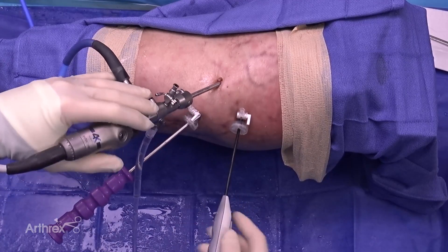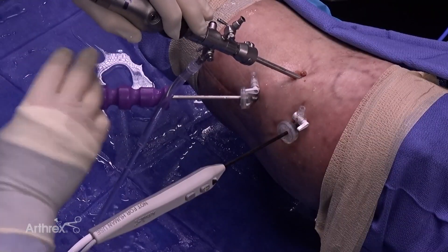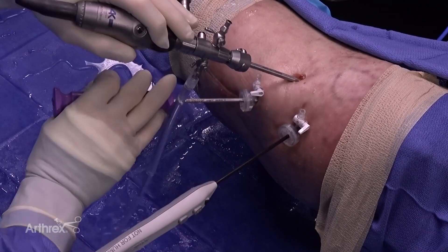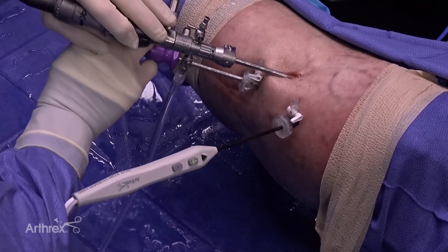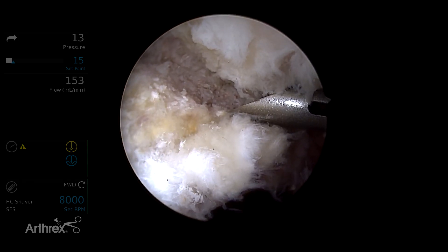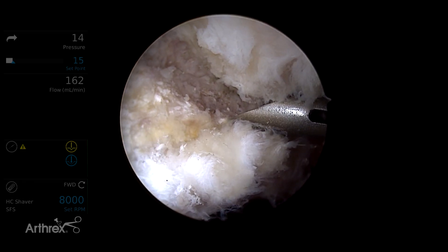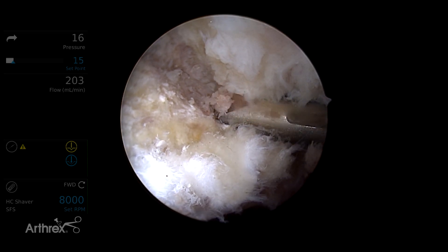We will now proceed with instrumentation using the DALA portal, which we've identified here. The DALA portal is used for drilling, suture placement, and anchor placement all in one. We'll start with drilling using a fish mouth guide at the anterior superior rim. This is the 12 o'clock anchor position.